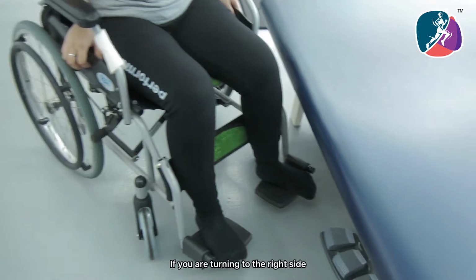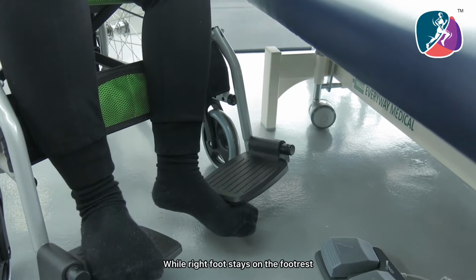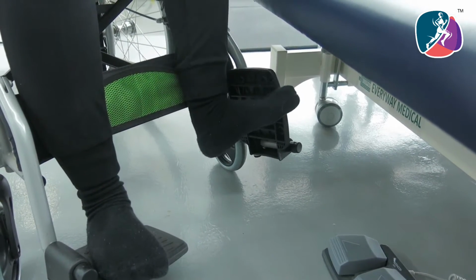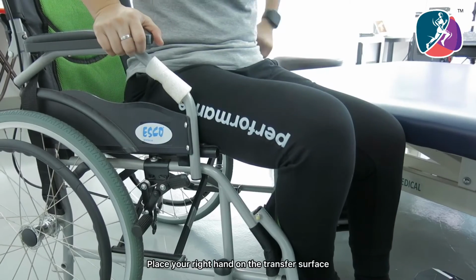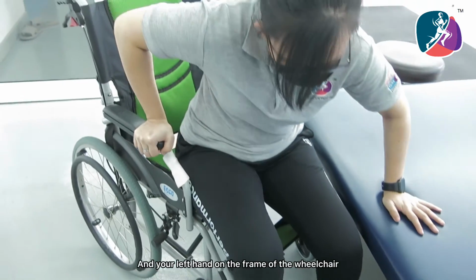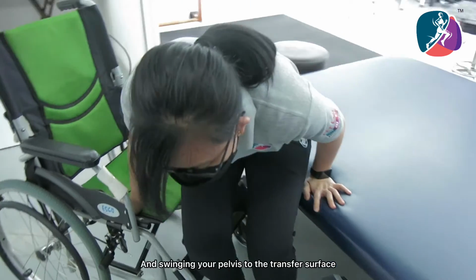If you are turning to the right side, your right foot should be placed in front in contact with the floor, while the left foot stays on the footrest. Place your right hand on the transfer surface and your left hand on the frame of the wheelchair. Lift up by pushing yourself up with your arms and swinging your pelvis to the transfer surface.